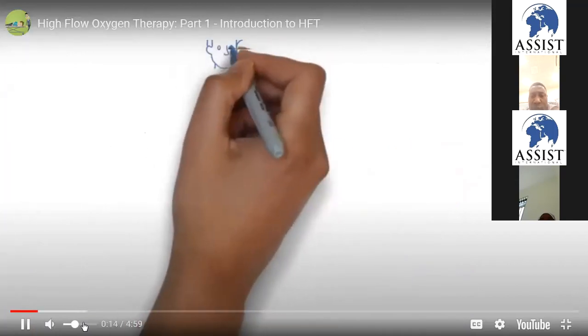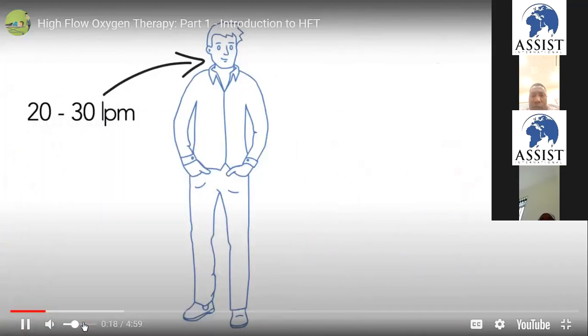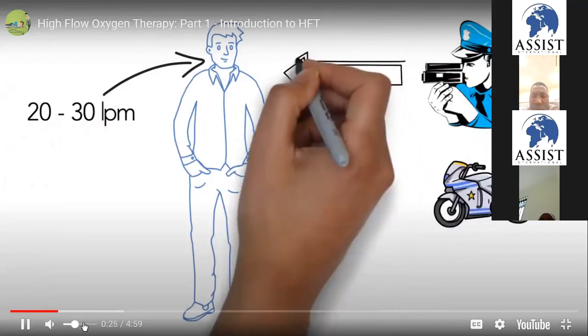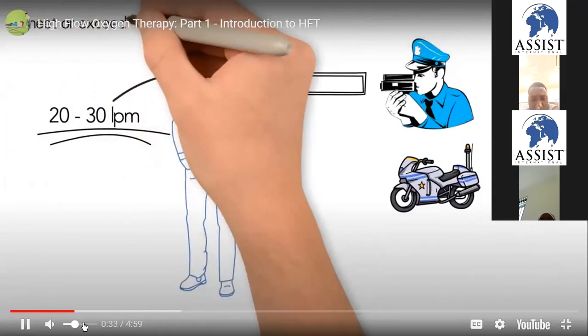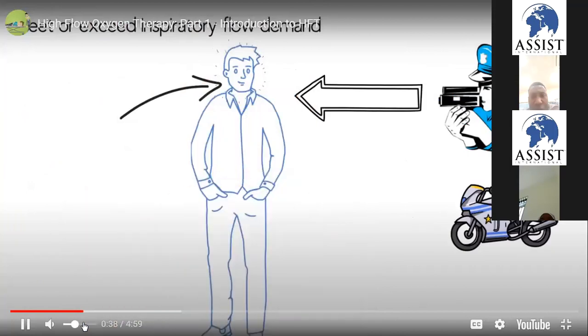Well, did you know that at rest, the average adult will inhale at a speed of 20 to 30 liters per minute? In other words, if someone was standing next to you right now with a radar gun pointing at your nose, capable of measuring how fast you're inhaling while you're relaxed, the speed at which you inhale would be around 20 to 30 liters per minute. So high flow therapy should be capable of matching the inspiratory flow, or even exceeding it.